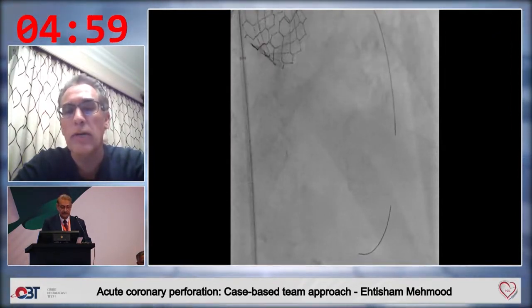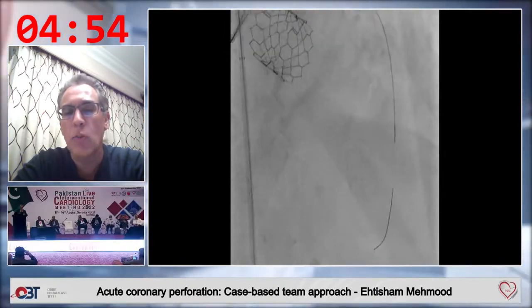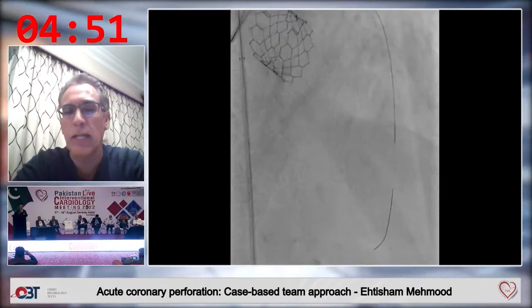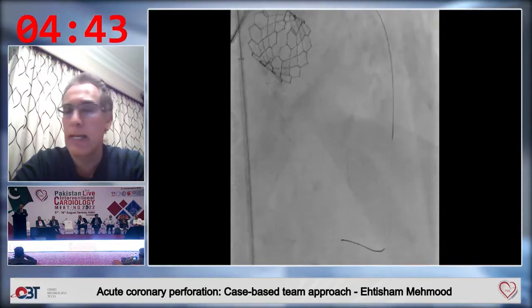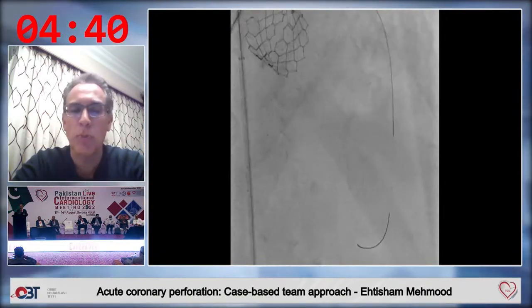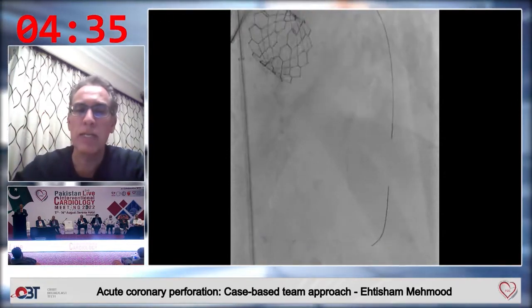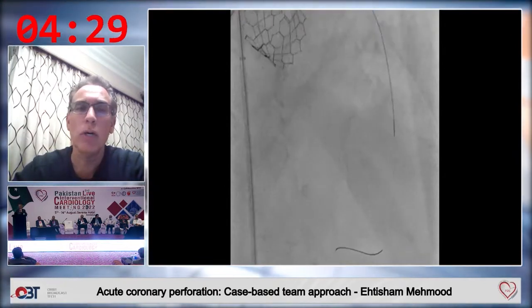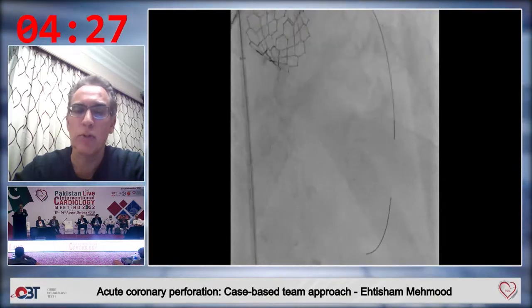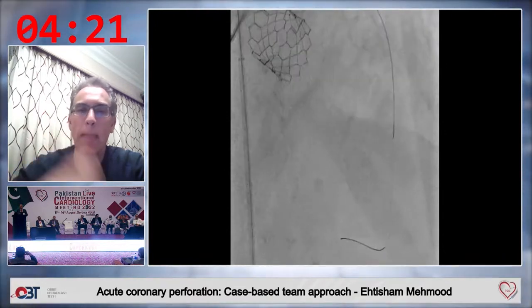So now there is a run-through workhorse wire, and you can see that the wire traverses what appears to be the apical LAD. Part of the reason I'm showing this is to caution everybody that when you get this wire down to the apex and it seems to go into multiple branches, we've traditionally thought that we're in the true lumen. So what happened next is that the Corsair Pro was withdrawn back and a 2.0 balloon was used to dilate that very proximal occlusion. And I will now show you the angio immediately afterwards.